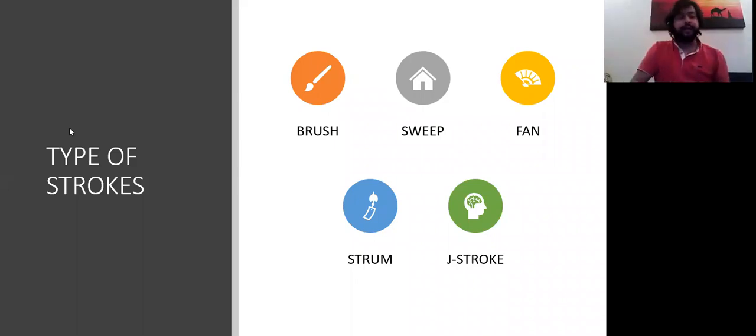So now you got an idea. Again, there is nothing specific that says you have to use a stroke in particular conditions. No, it's not like that. Again, I'm saying this neither about the tool nor about the stroke. You can use any tool over any condition, over any part. But with practice, you will come to understand that yes, this part will get released better with this kind of boomerang tool, or you need multiple curve tools, or maybe a handlebar. With practice, you will get to know.